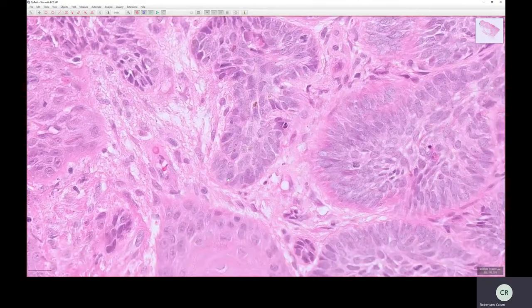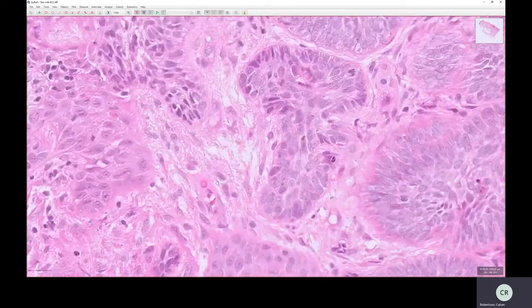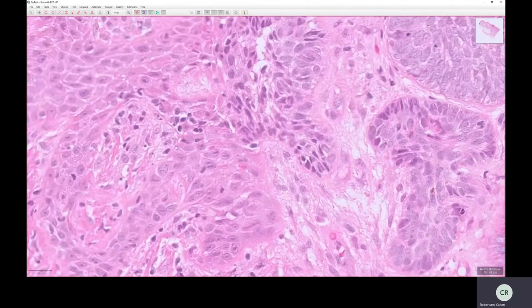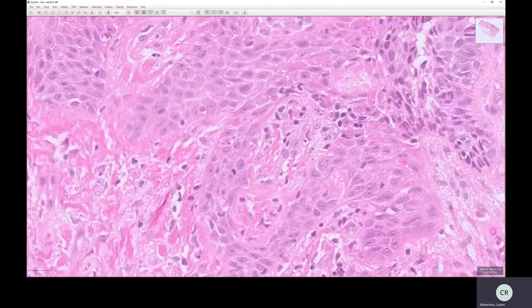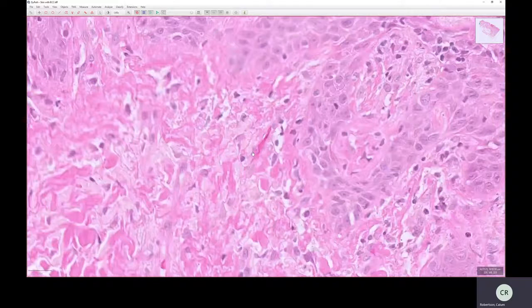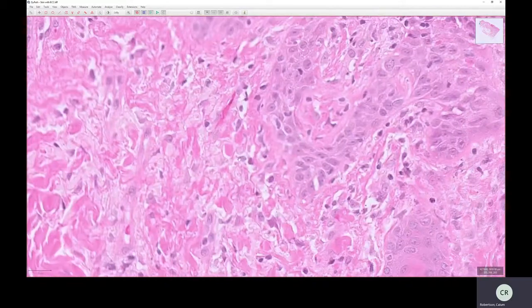The blue stuff here, or here, the round blue stuff, these are the nuclei, and they've been stained by hematoxylin. This hematoxylin stains the nuclear material blue. After that, we use an eosin counterstain, and eosin stains everything else pink. So it actually stains bases pink and proteins pink.